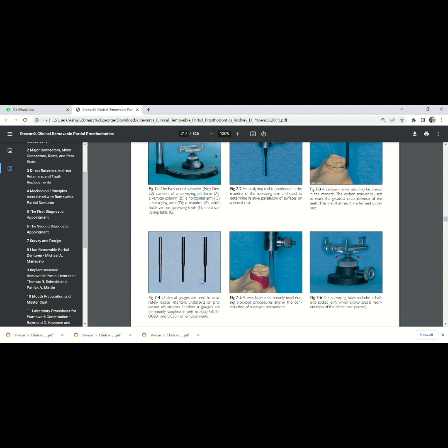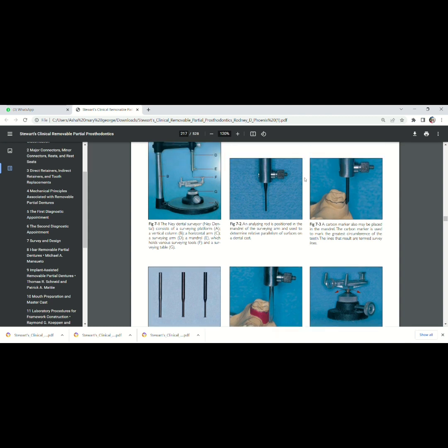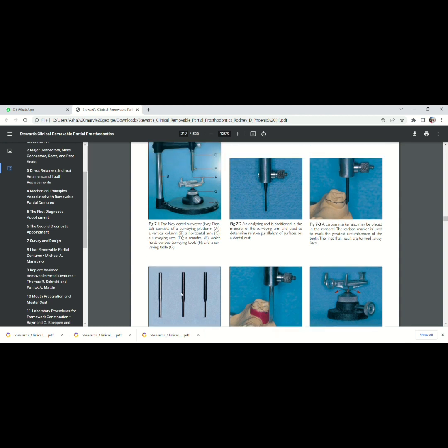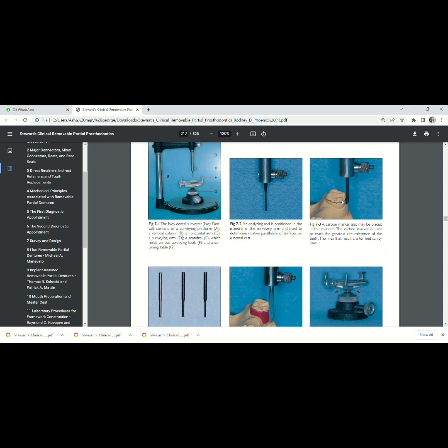So we can attach these undercut gauges onto the surveying arm. And if we place the cast over the cast holder, we can measure the undercut.